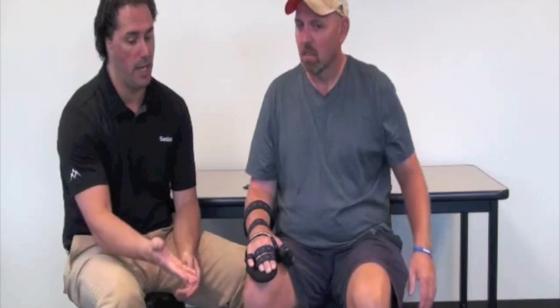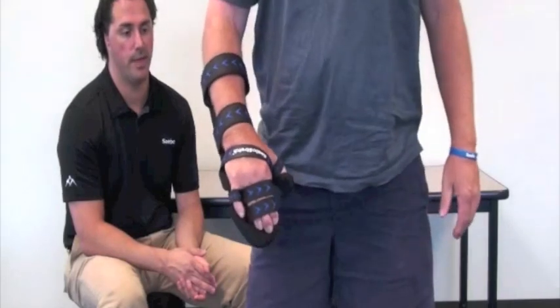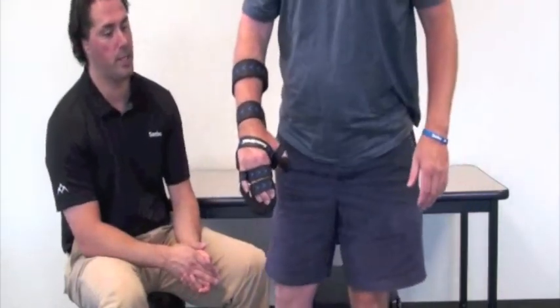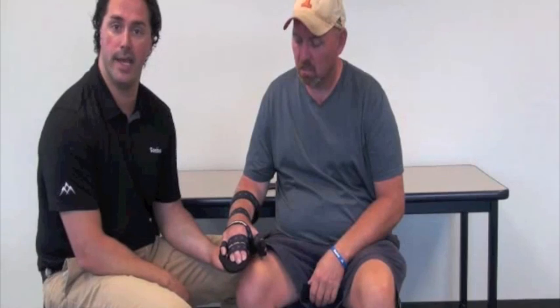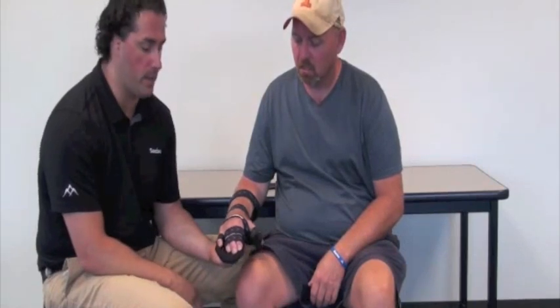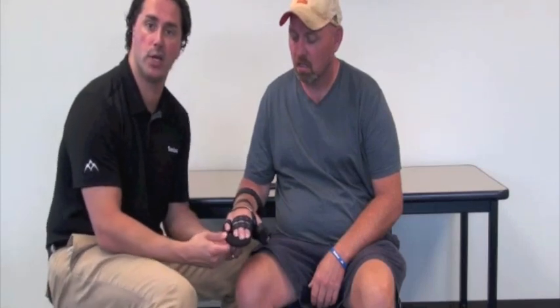Tony, I'd like you to stand up, walk two feet, and then come back and sit down in the chair. What we're looking for is to see if the fingers pull out of the splint and if we need to make any changes. As you can see, the fingers stay exactly where we want them. When the tone kicked in for Tony, it was very subtle — the dynamic hand piece bent into a little flexion and then relaxed. We're pretty happy with the position he's currently at.